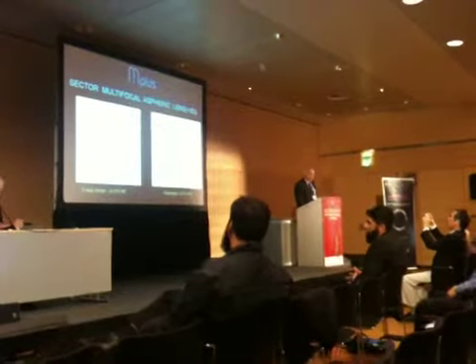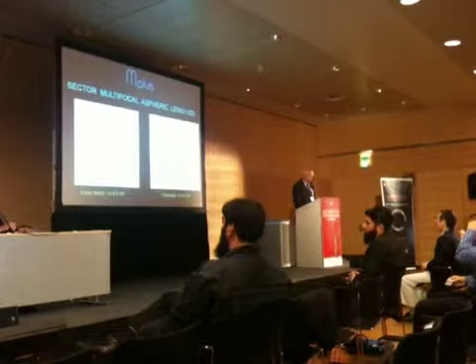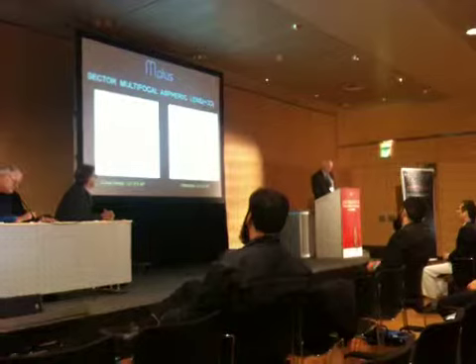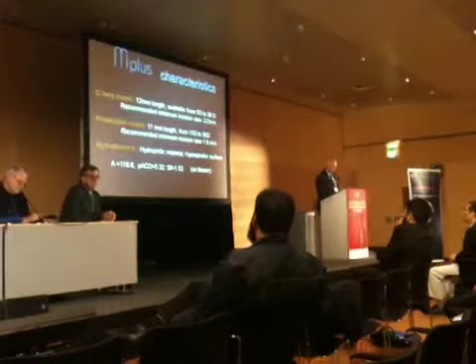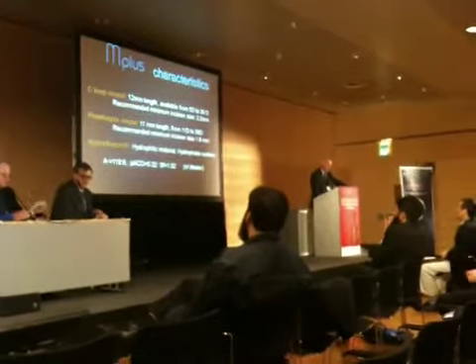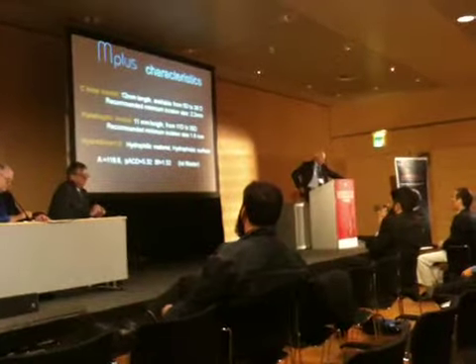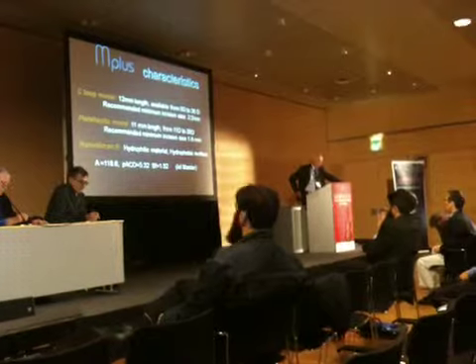In order to orientate the IOL best, you can see that on the optic part there are two marks, and this button. This is a model called C-loop. On the plate haptic model, there are two inferior buttons and one that has to be in the upper position on the right. The C-loop model has a 12 millimeter length, the other one is 11. There are some differences. The recommended minimum incision size is 2.2 for the first one and 1.8 for the second one. The material is called HydroSmart. It is a hydrophilic material with a hydrophobic surface.